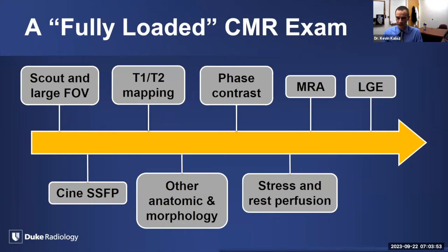I'm not going to go too much into it. I'll do a little bit of introductory material in terms of a basic protocol and basic sequences. Unfortunately, that would be at least one, probably even more lectures to go through the full protocol and how they work and how they're analyzed.